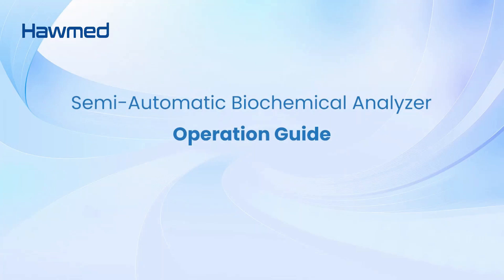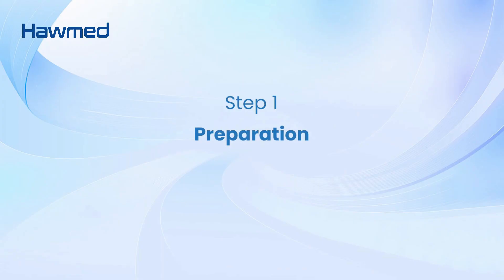Semi-Automatic Biochemical Analyzer Operation Guide. Step 1: Preparation.